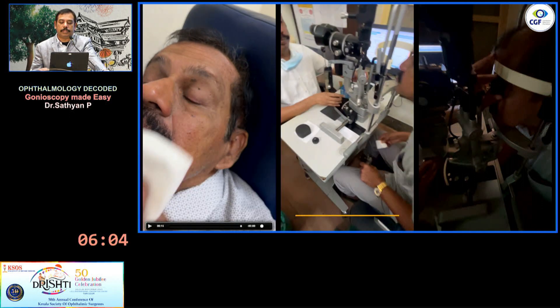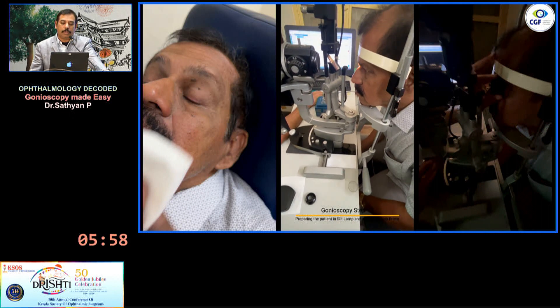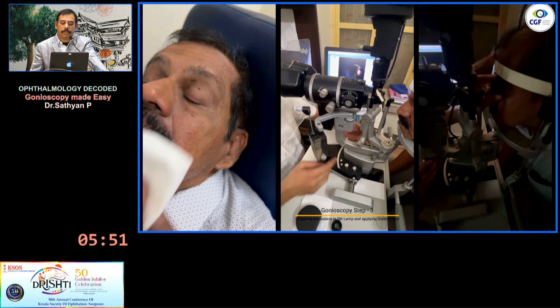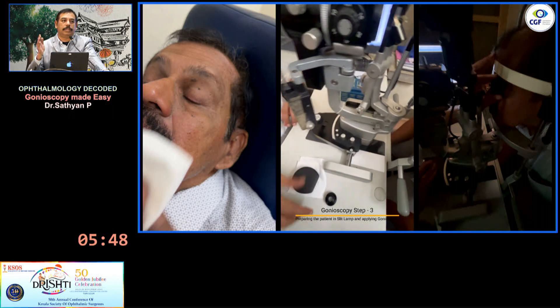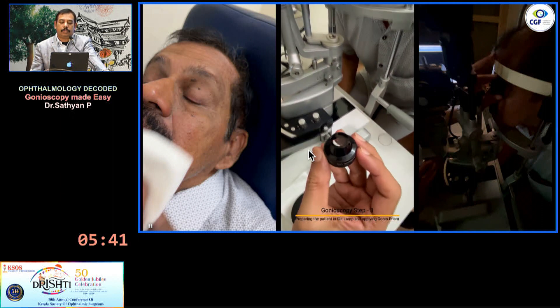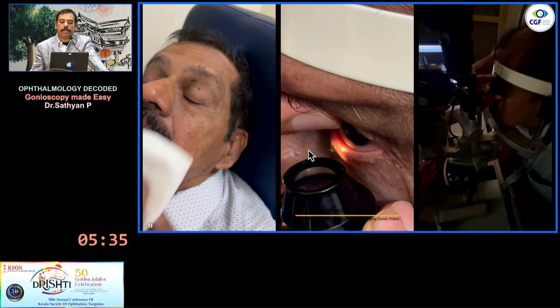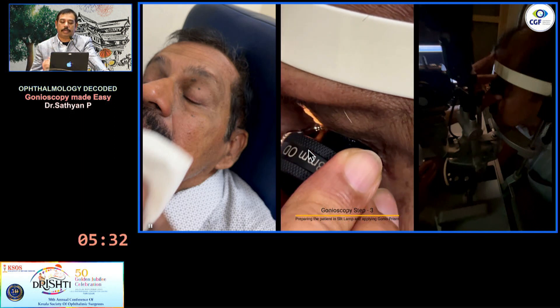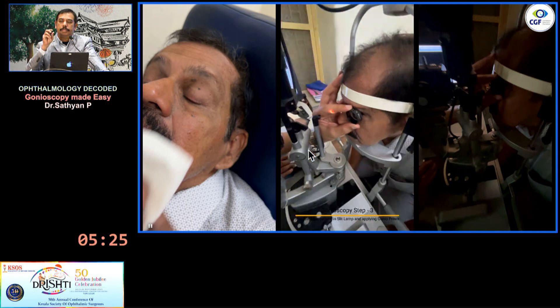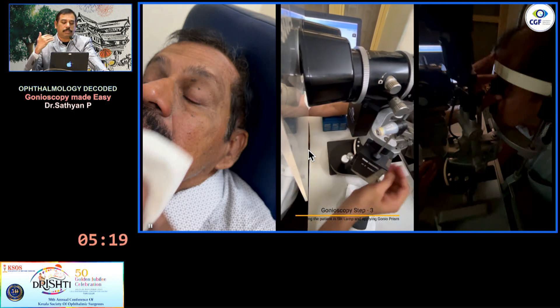The next step is preparing your patient for the slit-lamp examination. Make sure the patient is sitting comfortably without much of a head tilt. Ask the patient to look up, then adjust your slit lamp — turn it to the temporal side about 60 degrees so the angle is comfortably visible. When placing the lens, ask the patient to look up. Make sure you see the lower sclera comfortably, then push the lens in and rotate it so the mirror is on top, because the broadest or widest angle is the inferior angle — so start seeing the inferior angle first.